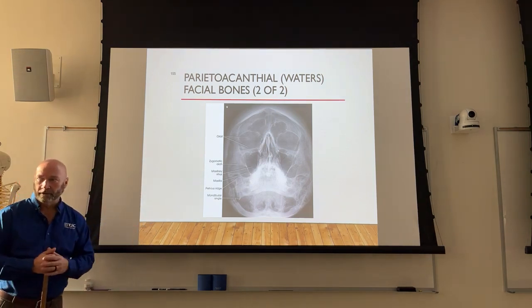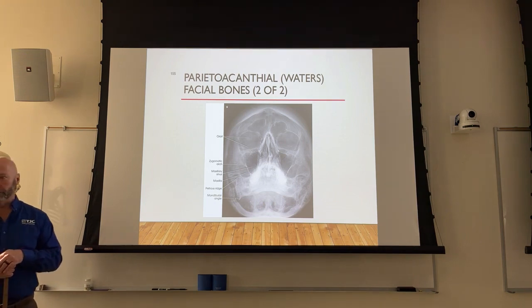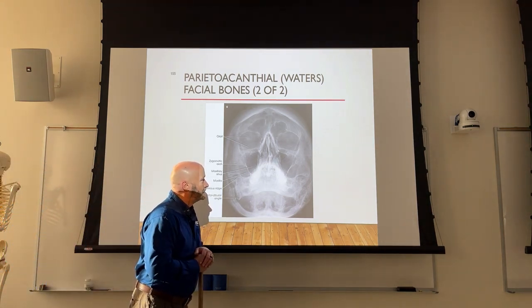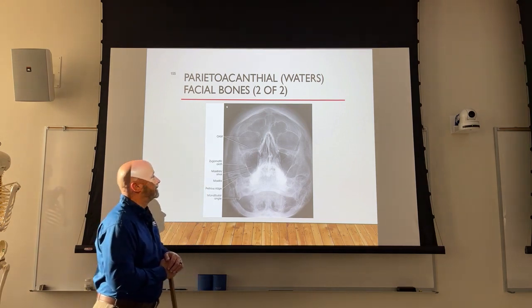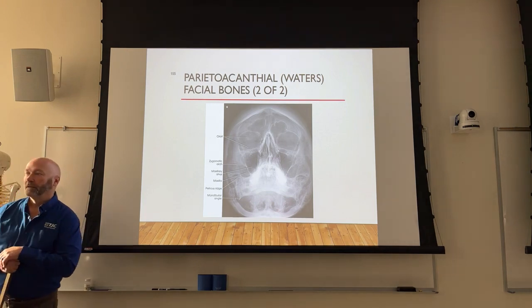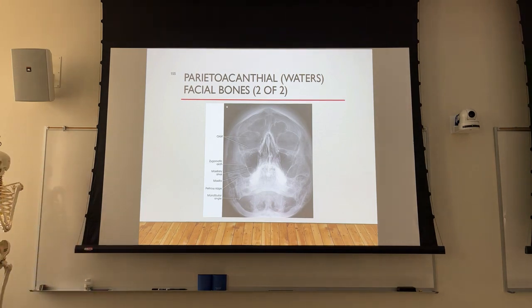Good view of the skull. Maybe the only good view of the skull. Okay? So what else can you see on that? That's probably close to it. Maybe something else, but nothing comes to mind right now. Mandible, a little bit on the mandible. So you see everything, just not necessarily everything really, really well.